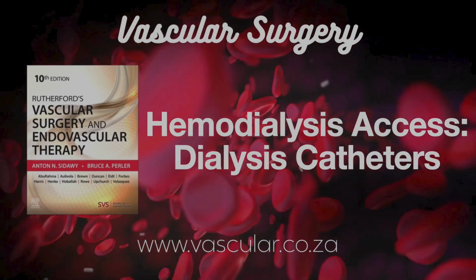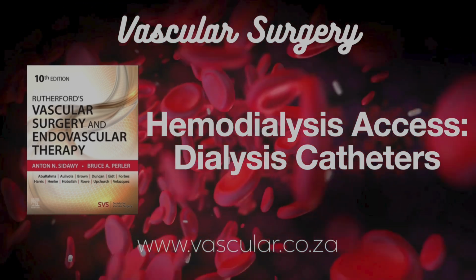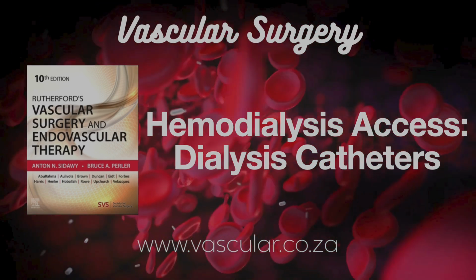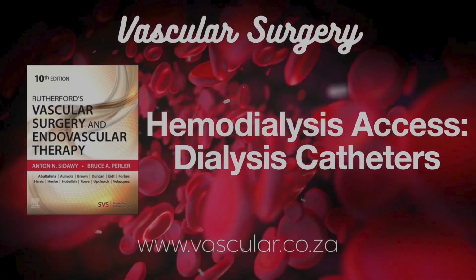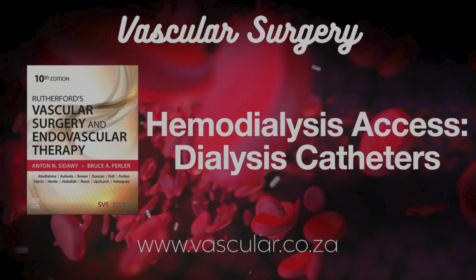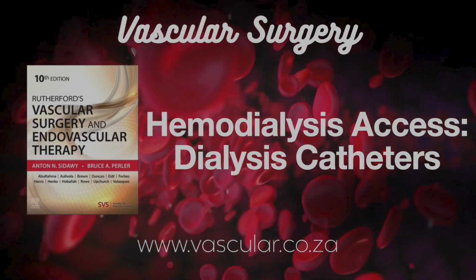Makes sense. Thinking long term. Does the catheter length vary depending on the site? Absolutely. For a right IJ, you're typically looking at 19 centimeters or often 23 centimeters from tip to cuff. Left IJ needs to be a bit longer because the path is more angled. And femoral, much longer. You need catheters over 40 centimeters to get the tip up into the inferior vena cava properly for good flow. The length is crucial for getting that tip placement just right.